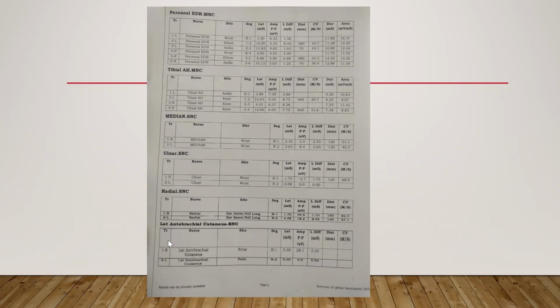Okay. But do you want to say this is pan-plexus, or it could be some one plexus? Why is it not fitting in one plexus? Ma'am, because if all three nerves are involved, one possibility is lower trunk also. But here as LABC is involved, that is a branch of the lateral cord. So the lower trunk is not supplying that, therefore the lower trunk possibility is not there. Correct. So LABC is involved, ulnar is also involved, radial SNAP is also low. So that is indicative of the possibility of pan-plexus involvement.